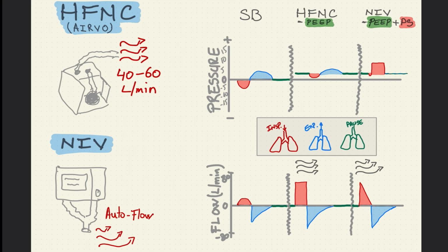Notice on the pressure graph that at the beginning of inspiration, as the diaphragm moves down, a negative pressure is being generated inside the thoracic cavity. The air starts flowing in from the atmosphere down towards the alveoli. And as the lungs are being filled up with air, the pressure starts equalizing with that of the atmosphere, and no flow of air takes place.